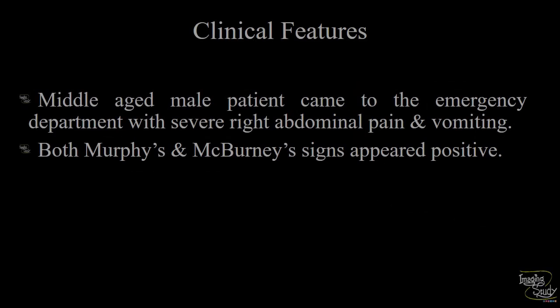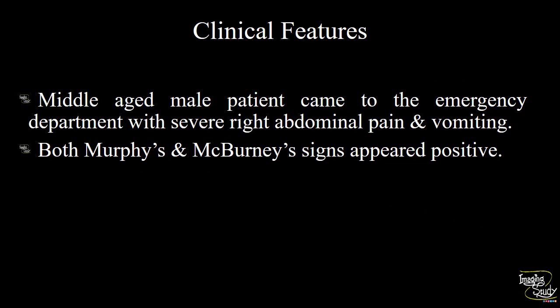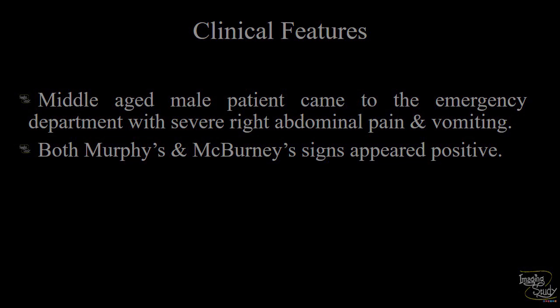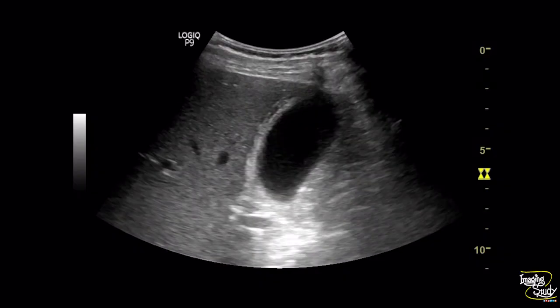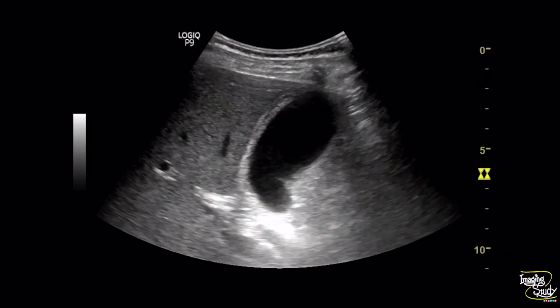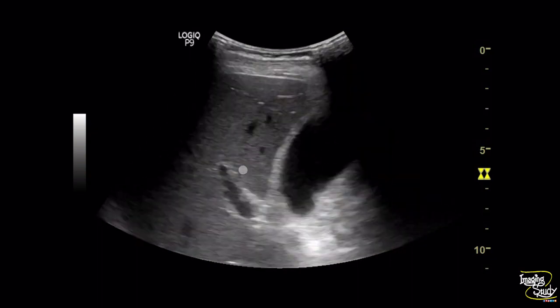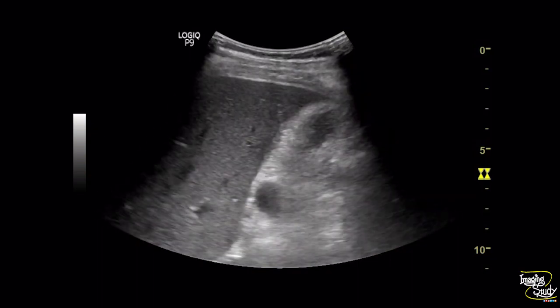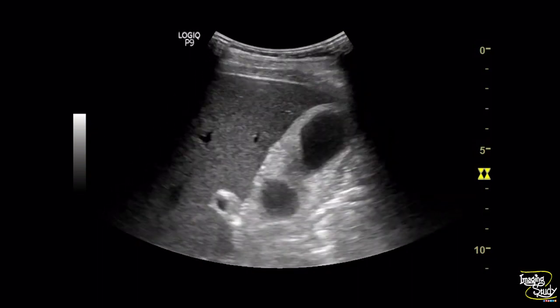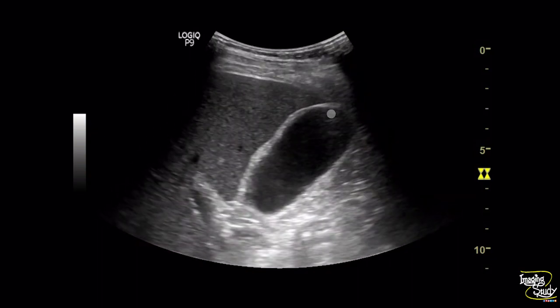Let's start case number two. A Middle Eastern male patient came to the emergency department with severe right abdominal pain and vomiting. The patient had both Murphy's and McBurney's signs positive. Here you can see the gallbladder of this patient — the wall appears thickened and edematous, and the lumen doesn't look distended.